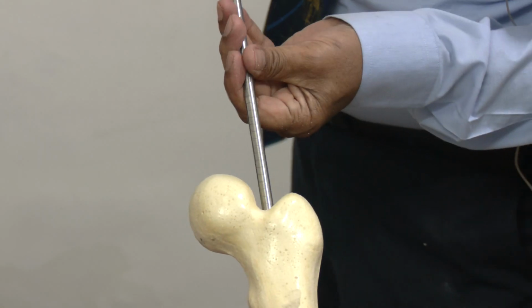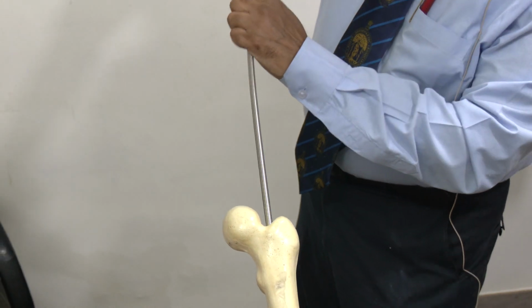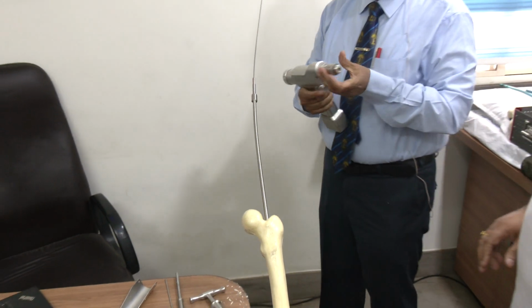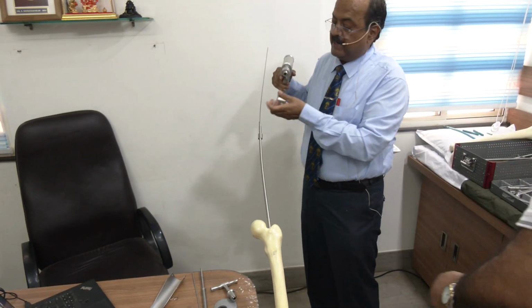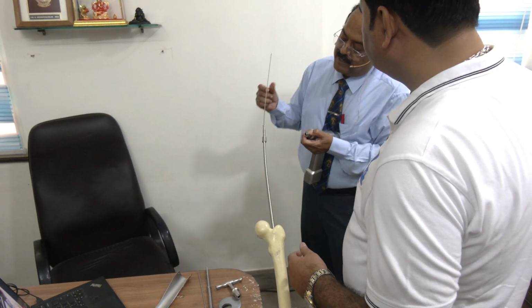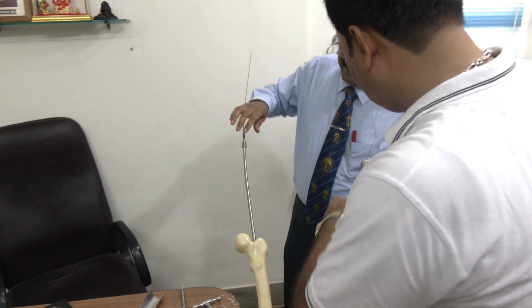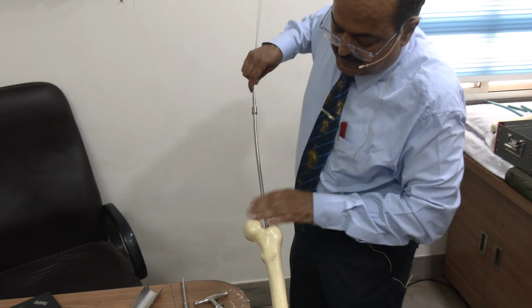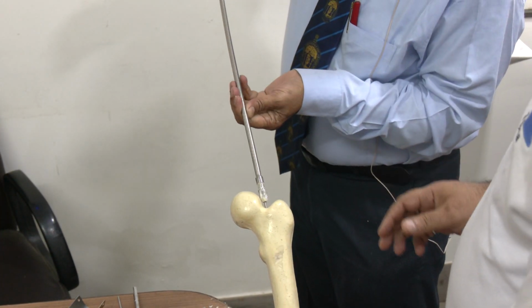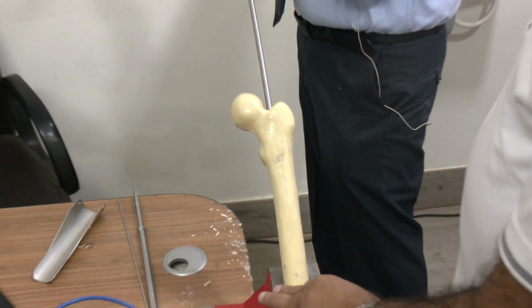Okay. So at this stage, now it is not going inside. Reamer drill bit, the drill machine dijiye. So what I will do is, I can drill this now. So with a reamer I can drill. Since there is no reamer attachment, I don't want to do it here, but you can just use the reamer attachment and pass it over this, and you can ream up to 12 millimeter. But now I have passed this much, so I'll see whether it is adequate for the nail to go. So nail will not go. I have to ream this now.